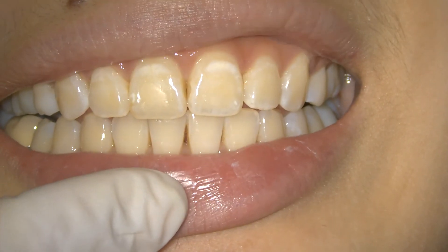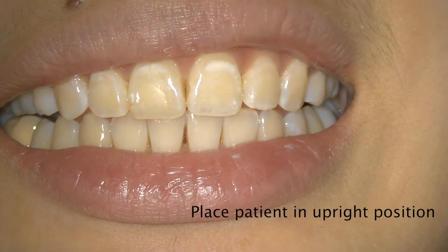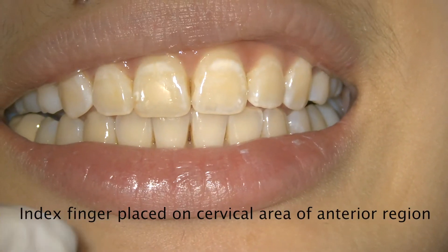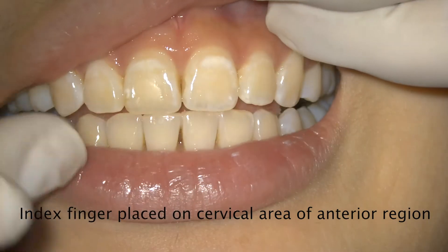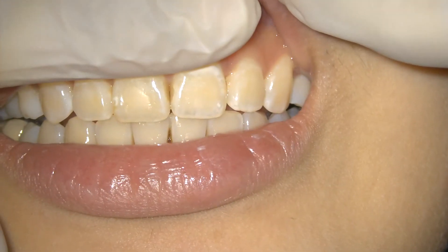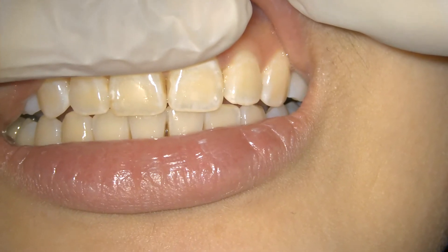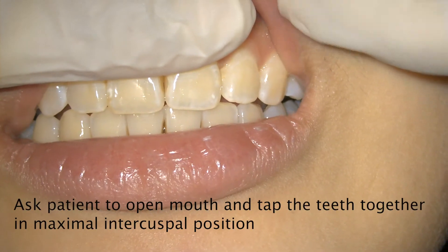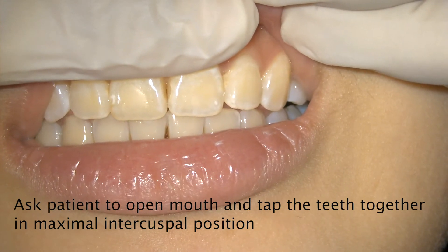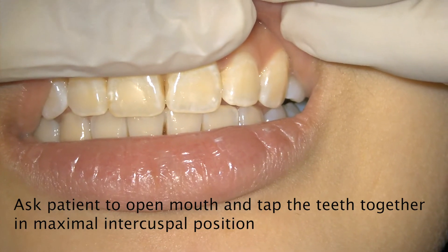For this test, you have to ask the patient to sit in an upright position. The index finger is usually placed on the cervical area of the anterior region. Once you place the finger like this, ask the patient to open their mouth and tap the teeth together in the maximal intercuspal position.